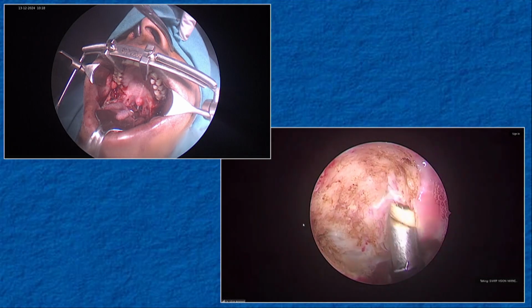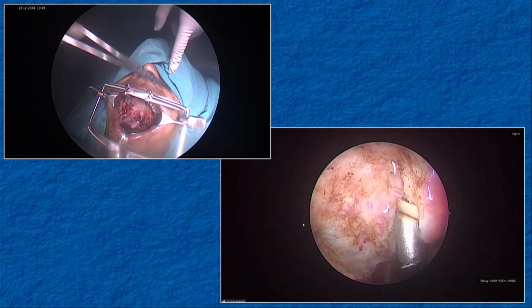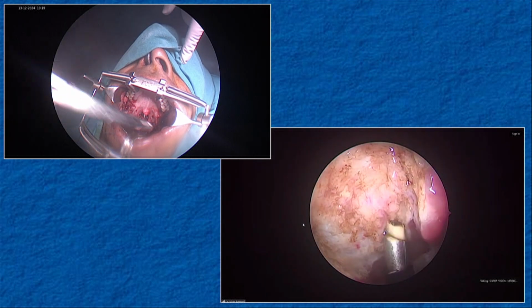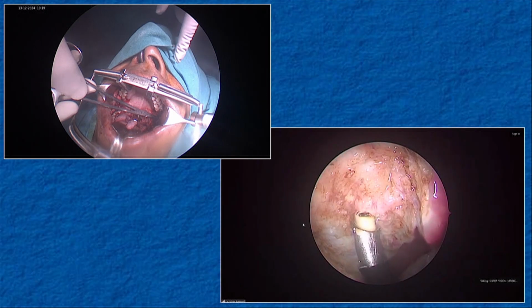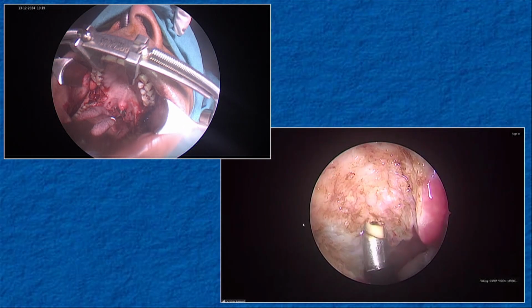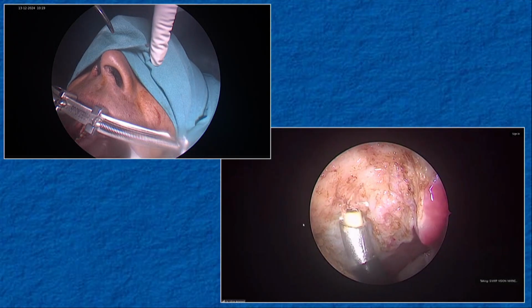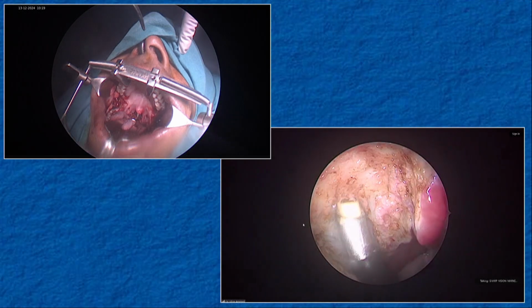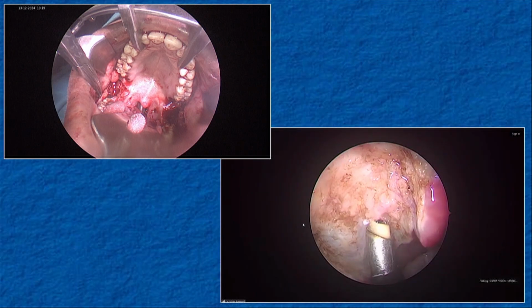Even if you take a long flap, the business area of the flap, the best part of the flap, does not reach posterior. The last part of the flap reaches posterior. So there are chances that we may not get good enough tissue, plus we have to violate the entire area in the cheek to reach there. On top of that, we have external scars in the cheek. All these things do not augur well. The easiest thing now is to put simple palatal flaps in this patient.